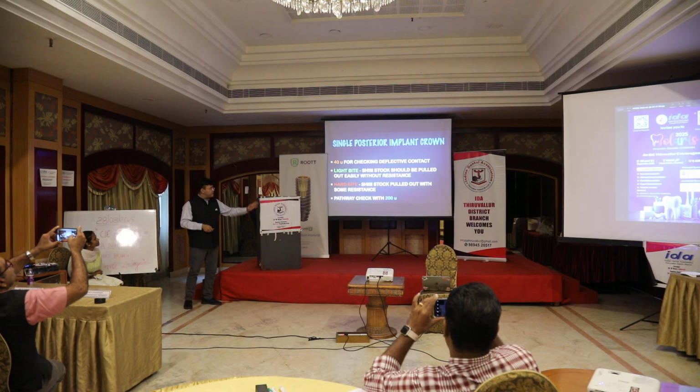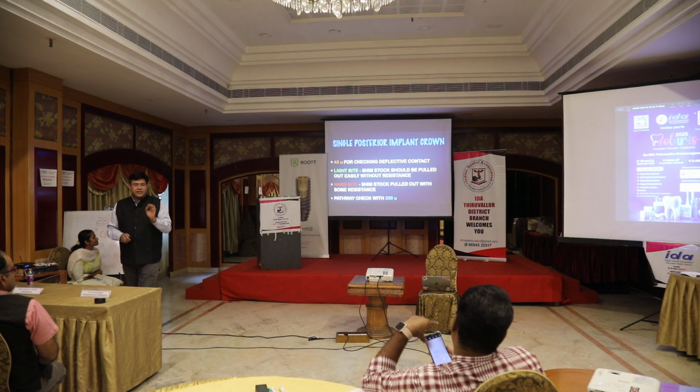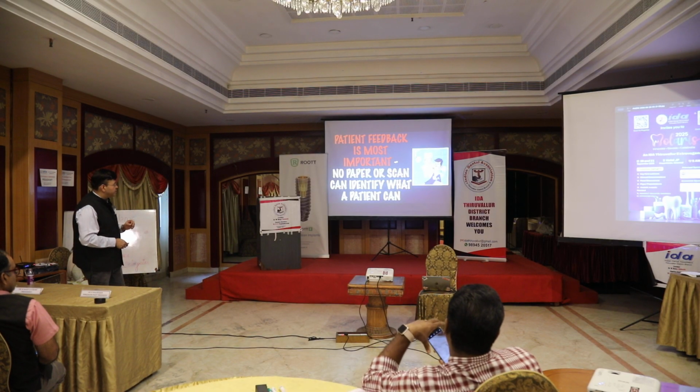Where to use what for a single crown? 40 micron for checking the deflective contact. Light bite, hard bite, and pathway check with 200 microns. These are the steps you need to do for a single posterior implant restoration.